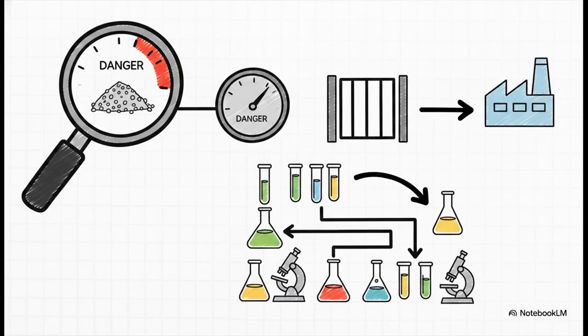Right, you absolutely must assess the criticality and variability risk of the change before even deciding on what qualification you need. Even a super minor raw material change can completely disrupt a sensitive living cell culture. This risk-based assessment is what dictates your next move. If the risk is high, that triggers a whole cascade of additional qualification testing before that new material is ever allowed anywhere near your production line.